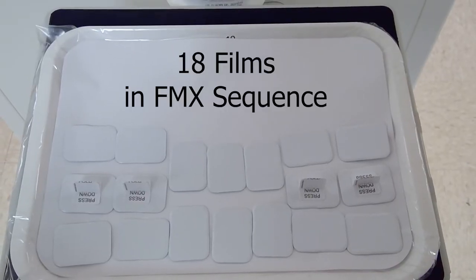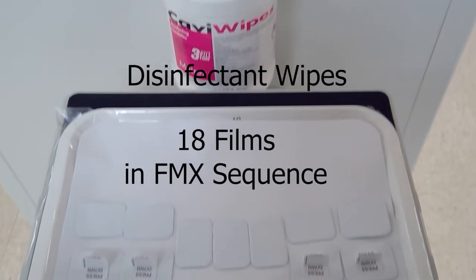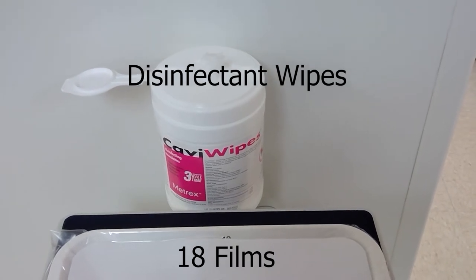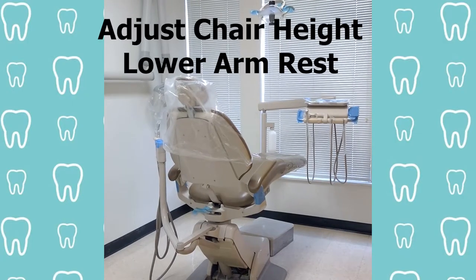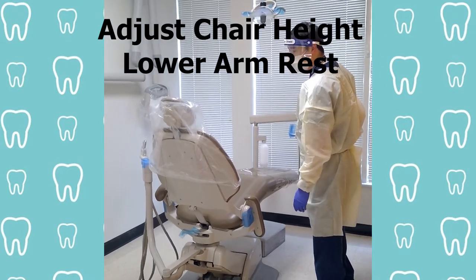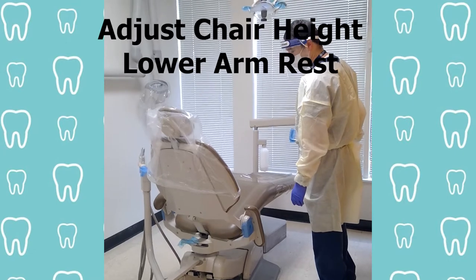Set up your 18 film sequences in order. Be sure to have a disinfectant wipe to wipe every film as it comes out of the mouth or the sensor when we're all done. Raise or lower the chair to the proper height so the patient doesn't have to climb or fall into the chair. Lower the armrest for ease of access to get in.